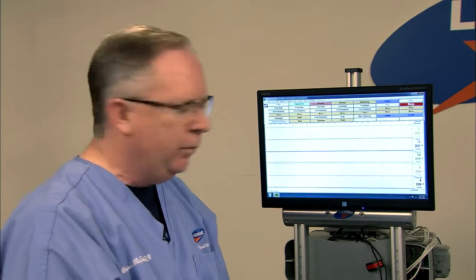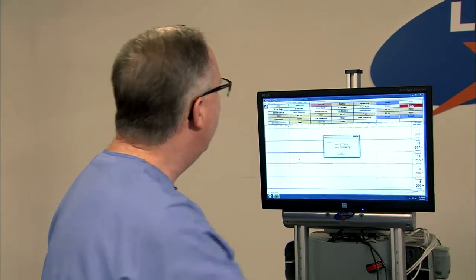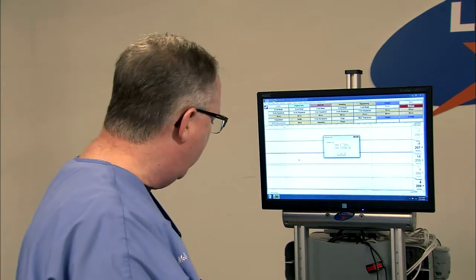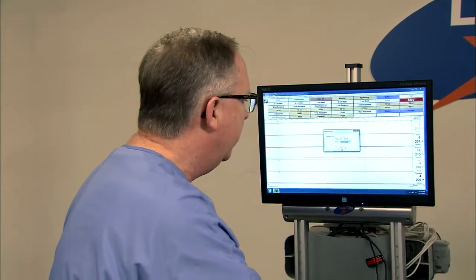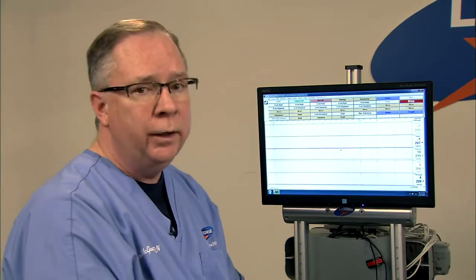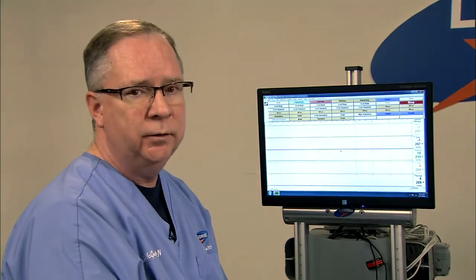And it's simply, did they do it? Yes or no. If they've done it, then we go ahead and click the expulsion test. We're going to then say how much water or air we had in the balloon. We'll say 50 cc's because that's what we did. And then the result is either expelled or not expelled, and then click OK. And at that point, we are essentially now done with this portion of the testing.